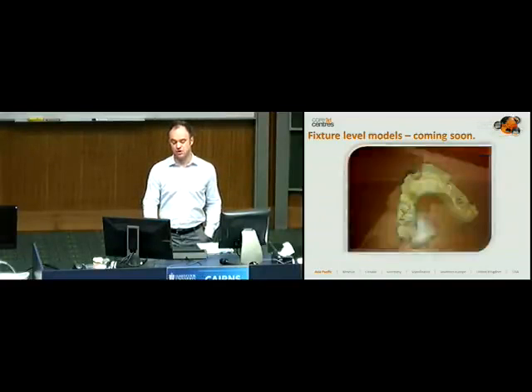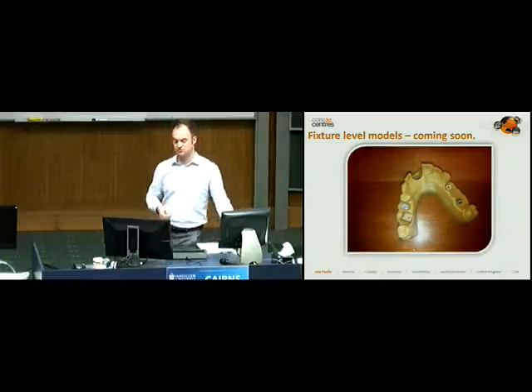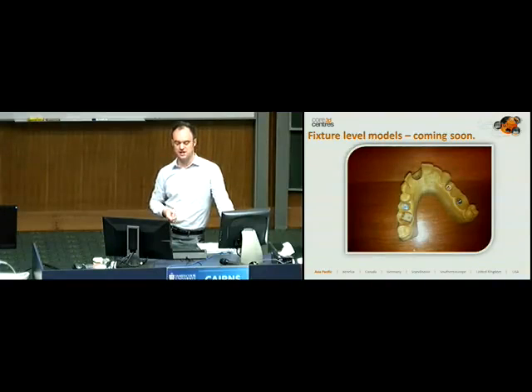Core 3D are also working on a solution where we actually rapid prototype the models, and you can see even on this really bad picture, the detail is a little bit better. You can see there's multiple fixtures and removable dies. And there's a piece of software called Model Builder that allows you to really control the design of that model. So we're moving very fast in this field, and certainly implants is the next big thing for this technology. And Core 3D are certainly leading a lot of the research and development in that area.